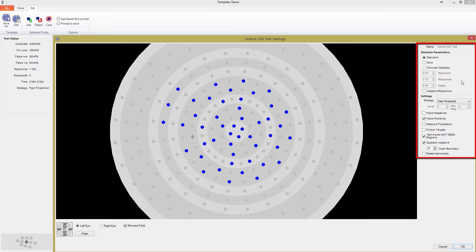If the patient sees the stimulus and responds, the software will wait for the length of time selected in the delay box, before exposing the next stimulus point. If they don't see the point, the next point is exposed as soon as the response time has fully elapsed.